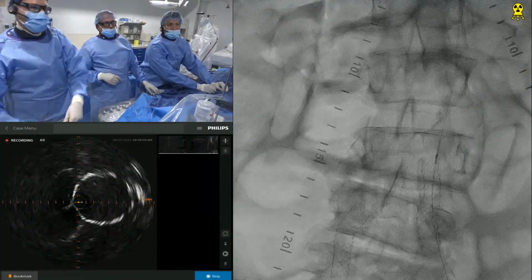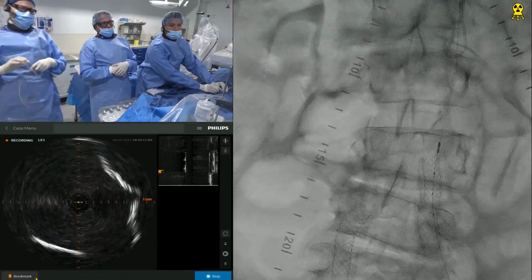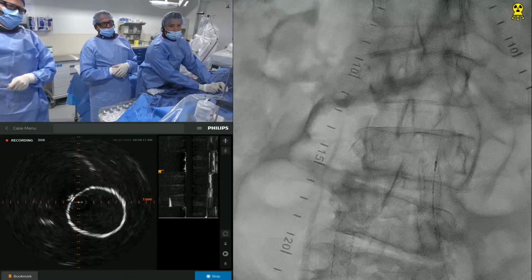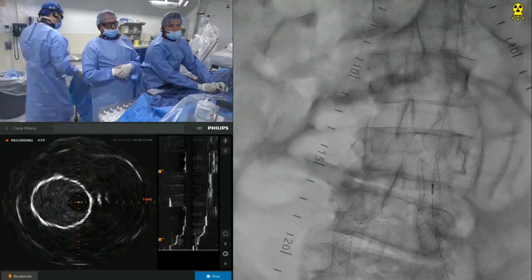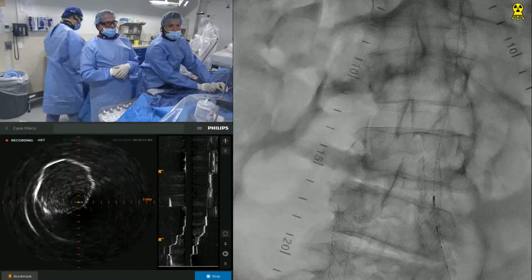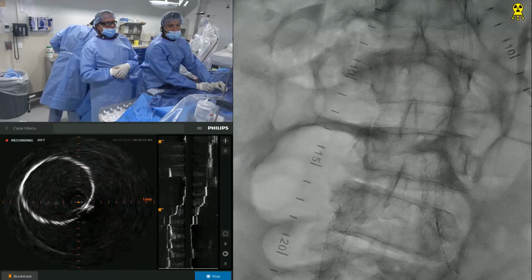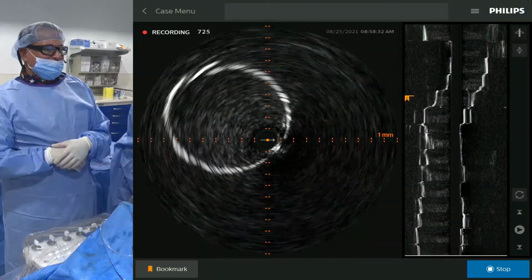Record. Oh, we nailed it. Look at this. Go back and forth. Oh, my goodness. Nailed it. Wow. Nailed the ostium. There's a great baking show, Ramen, called Nailed It. It's an awesome show. But anyway, we nailed it. Look at this. This is amazing. Very well expanded stent as well.